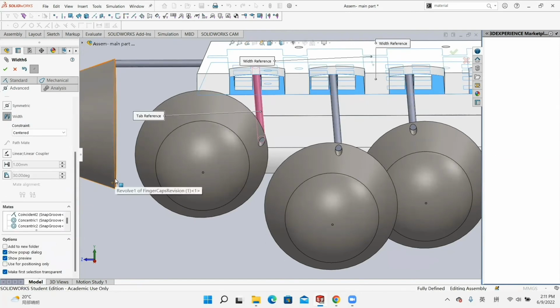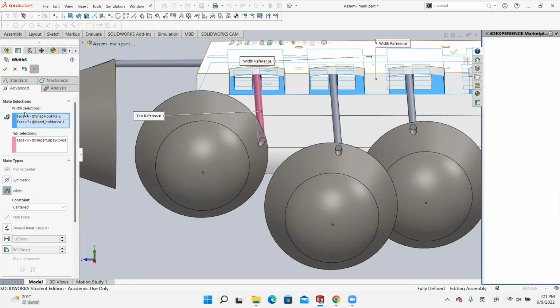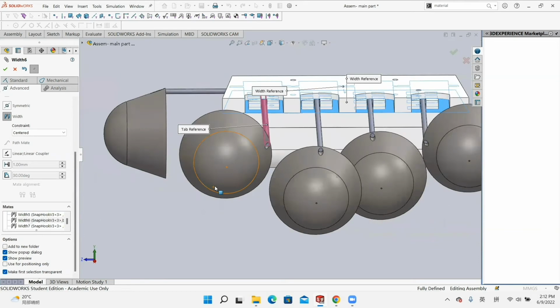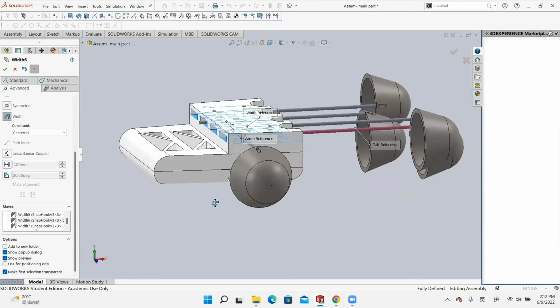And since we already have put the elastic cord between the gaps of the hooks, we also want the elastic cord to be placed inside the band holder and the snap hooks part. So we use another width selection by choosing the top face of the snap hook and the inner bottom face of the band holder, and tab selection the elastic cord. So it can perfectly go through the gaps, and we do the same for the rest of 4 elastic cords.